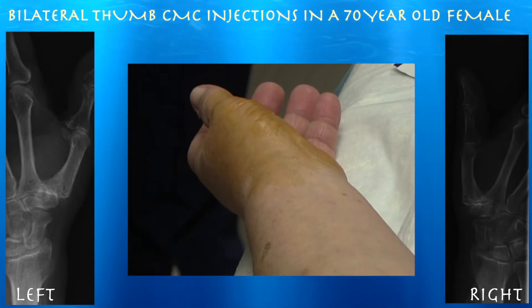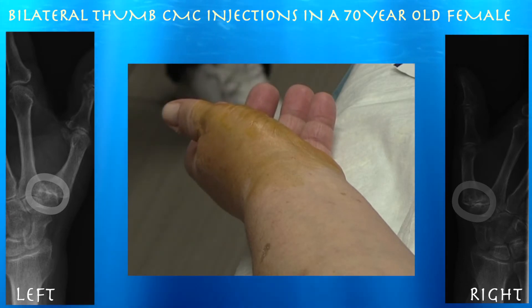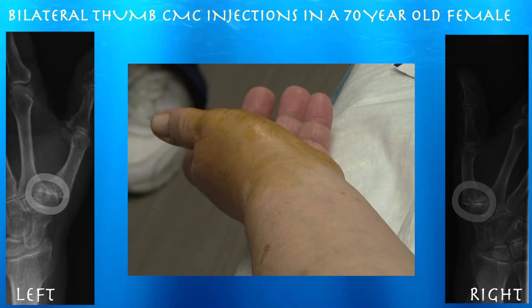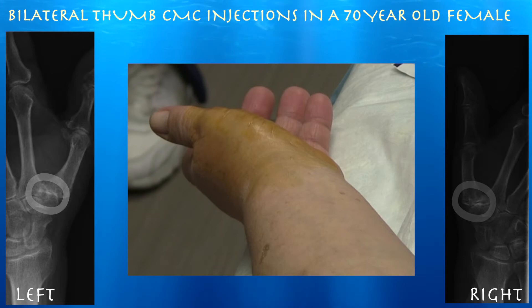This is a 70-year-old female here for pain in both thumbs. She has significant osteoarthritis in the first CMC joint. We're going to go ahead and inject it with some cortisone and a touch of lidocaine — about half a cc of methylprednisolone with a quarter cc of lidocaine.